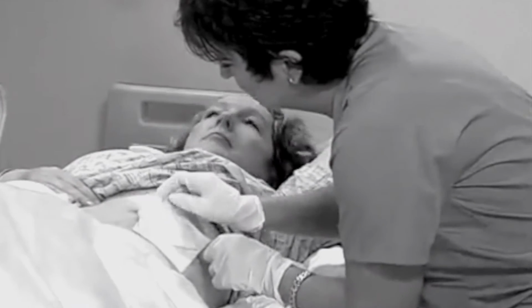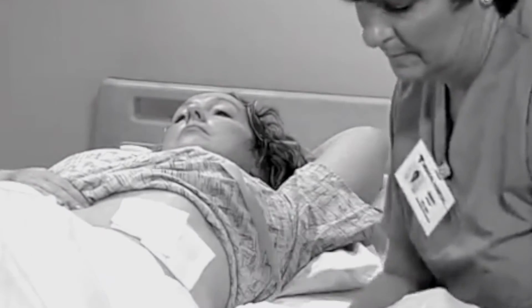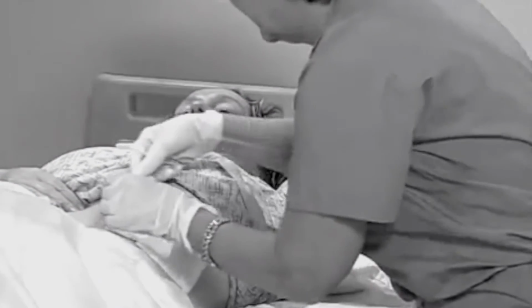And researchers hope that HIFU will, for the first time, enable treatment of abscesses smaller than 3 centimeters. What we can do with HIFU is treat these small abscesses, instead of having the patient sick and waiting for the abscess to grow big enough so that they can be treated by drainage.